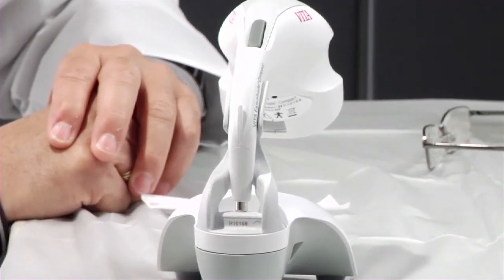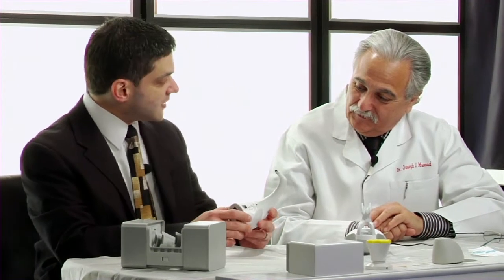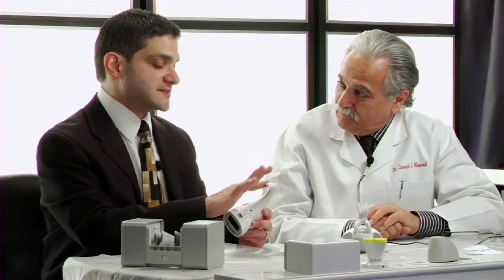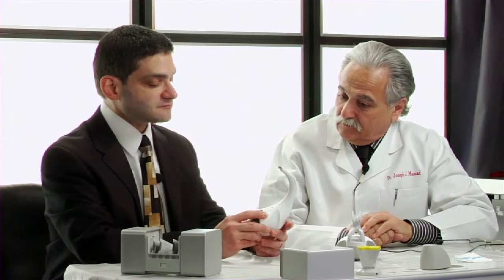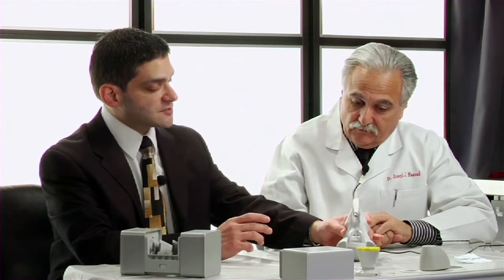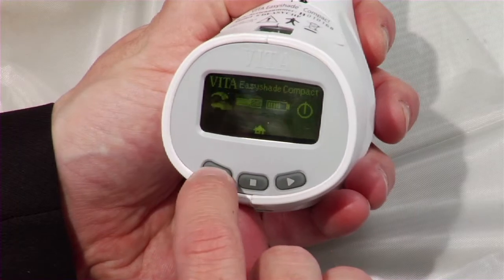This is the Vita Easy Shade Compact — the second generation of the Vita Easy Shade. You can see why we call it compact: it's very small. It differs from the first Easy Shade in several ways. First, it has an LED white light source — the first unit had a halogen bulb, so the LED will not burn out and will always be consistent. Second, there's no cord — it's wireless, rechargeable in its cradle, and with a full charge you get up to a week's worth of shade taking without a problem.